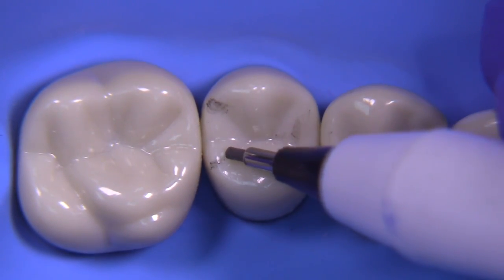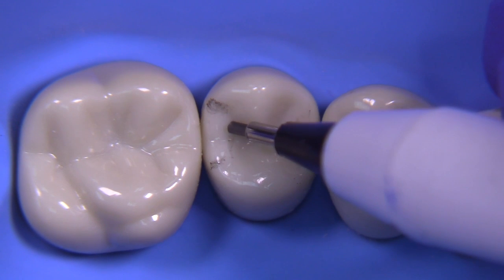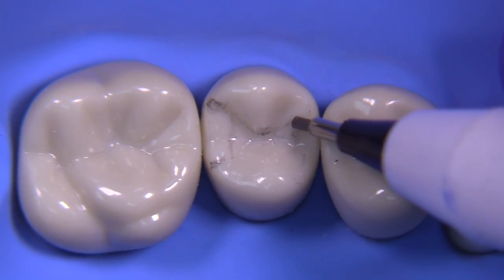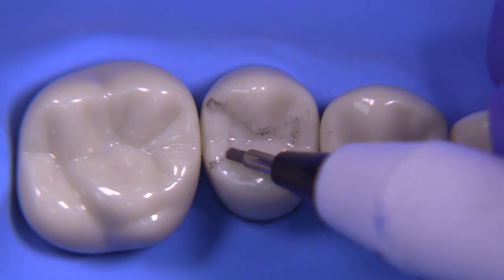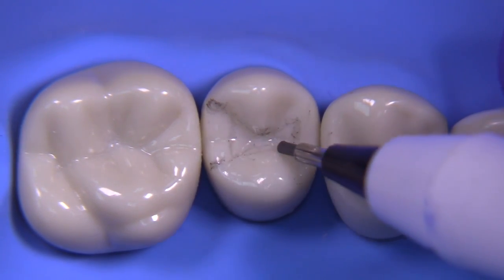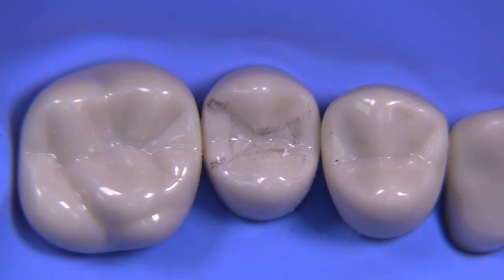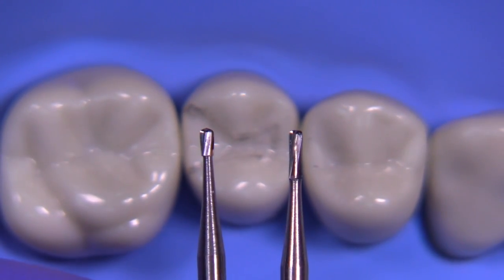I do this mainly for demonstration purposes to give you an idea of what the outline form is going to be. It's important to respect the triangular ridges with your outline form, to go around them but not cut through them, and have everything flow.